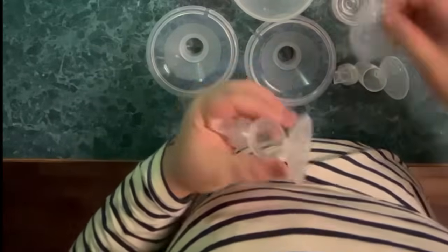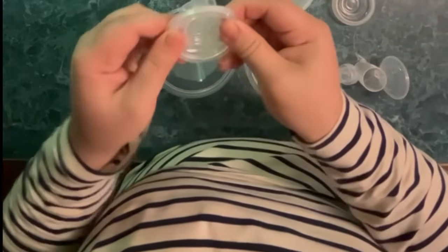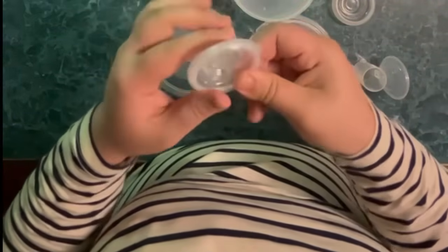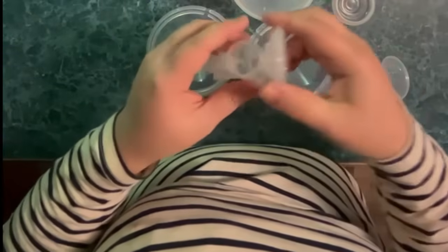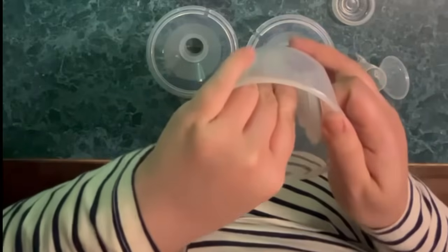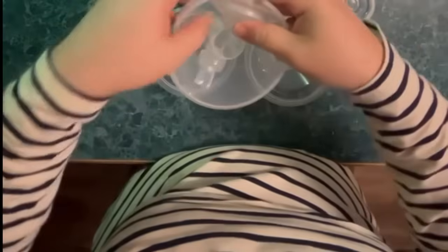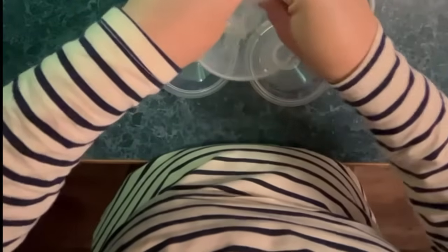Now I'm putting the silicone diaphragm into the linker and pressing the edges to fasten tightly. I am now assembling the linker into the milk collector with the ear part of the linker aligned with the internal slot of the milk collector, and pressing the linker disk part with both hands to fasten the edges firmly to ensure complete sealing. This is the ear I was talking about earlier.